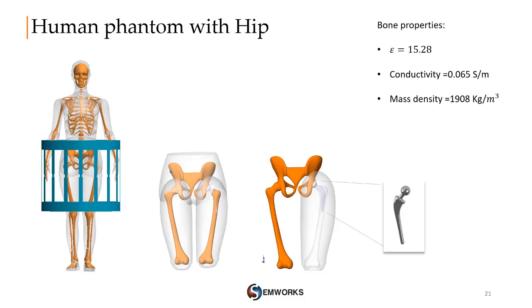We move now to the last part, in which we will try to approximate our simulation to the real conditions by using real human skeleton geometry inside biological tissue with the first hip implant that we studied with the rectangular ASTM phantom. For the tissue, we will keep the same properties as gelled saline, and for the bone part, we will use the following properties.